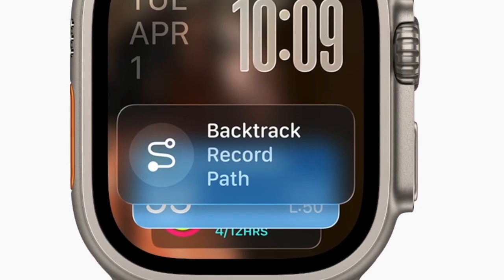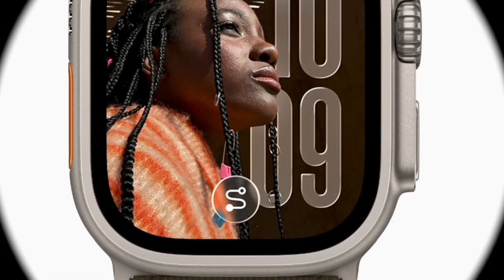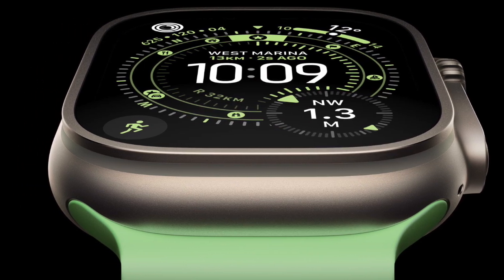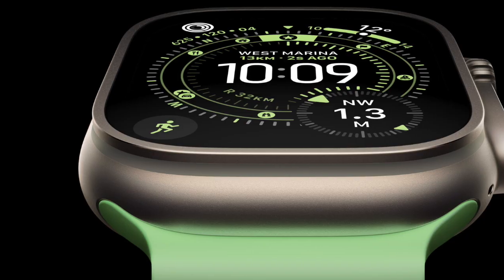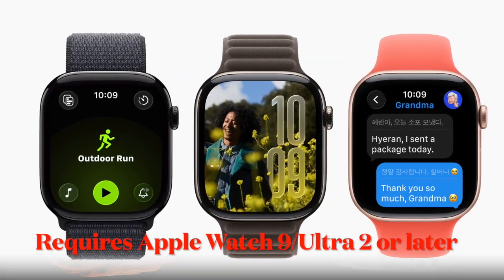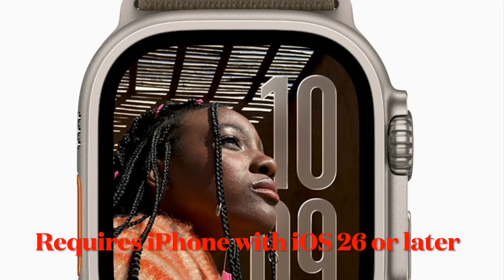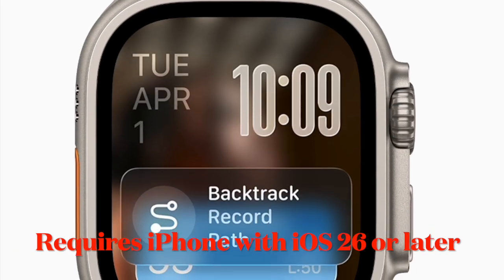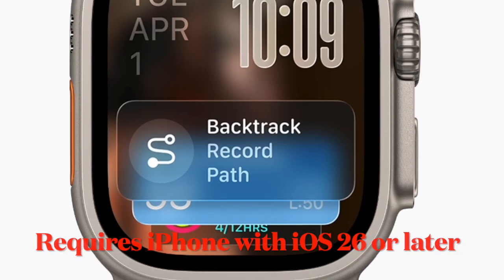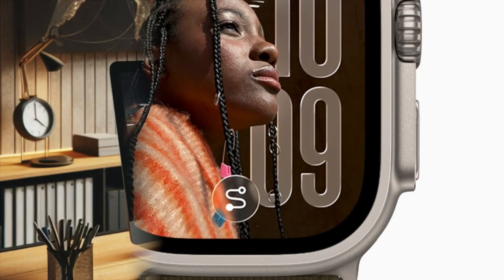First, let's talk about the important requirements for activating hypertension notifications on your Apple Watch. It's worth pointing out that only Apple Watch Series 9 or later, or Apple Watch Ultra 2 or later, running the latest watchOS version, can enable this new feature. Additionally, you must have an iPhone 11 or later with the latest version of iOS installed.